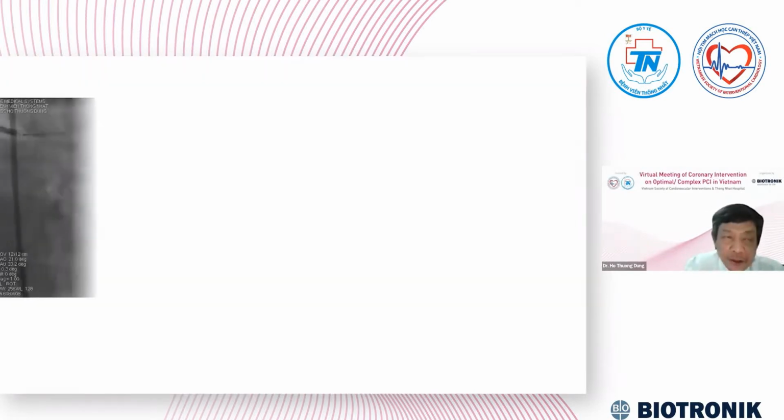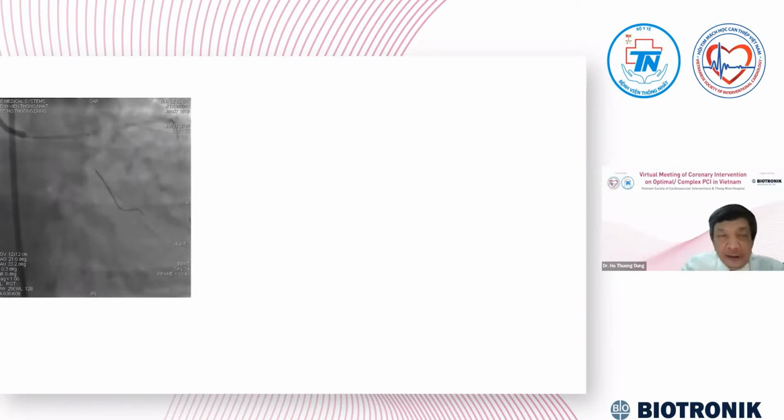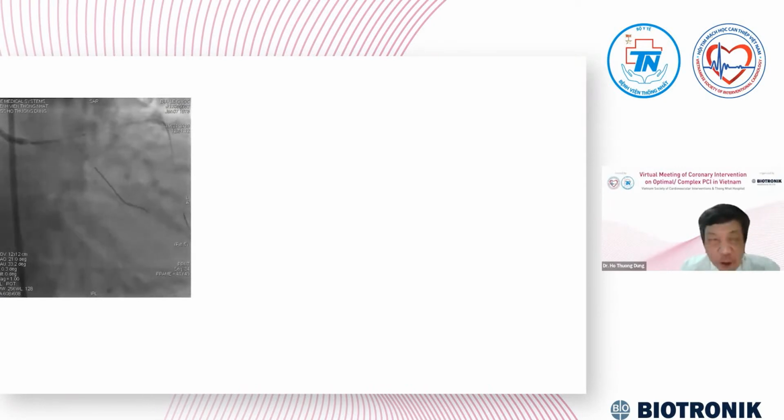And we went to the distal left main, and in this position we had one question: do we keep the circumflex or not, and how to keep it? I think if we deploy a stent in the distal bifurcation, the circumflex may go away. And how much diameter? In that situation and at that time I had no experience.